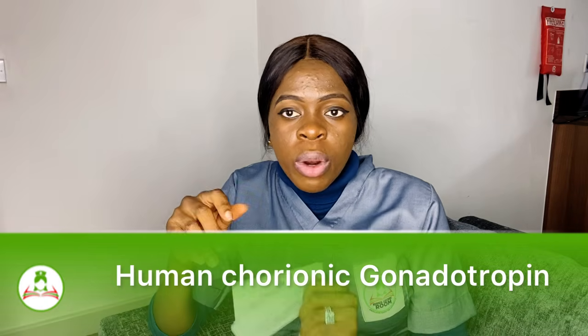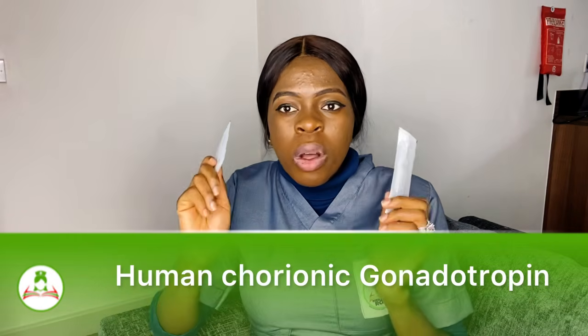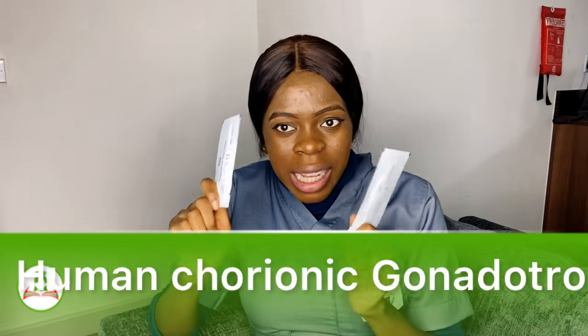You see this strip. First of all, let's start with this. This pregnancy test strip that you use in the house to do your pregnancy test, it's actually detecting one thing from your urine. Just one thing, which is known as the human chorionic gonadotropin. So that is what this strip is detecting from your urine. So for those that are asking, what's the magic in it? Yes, it is detecting that from your urine.